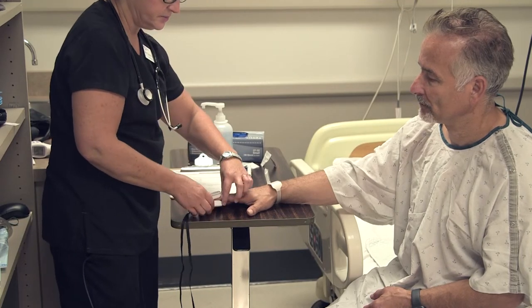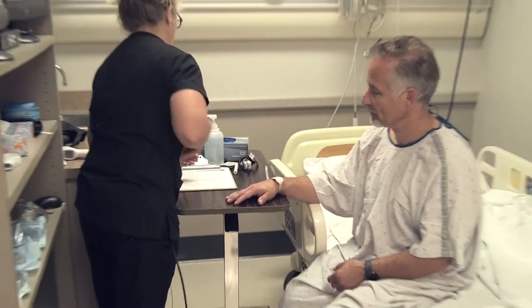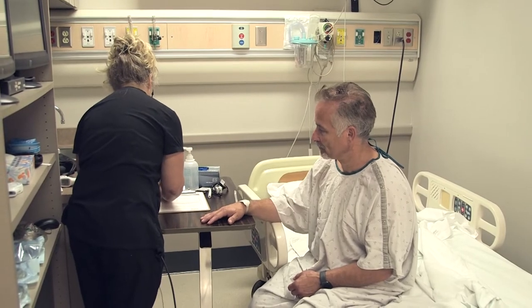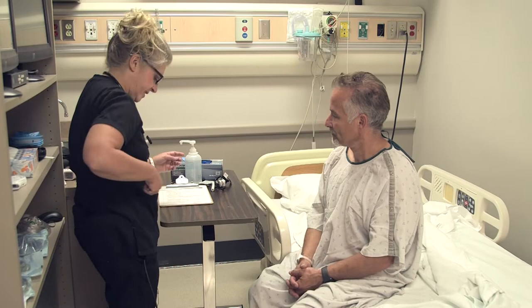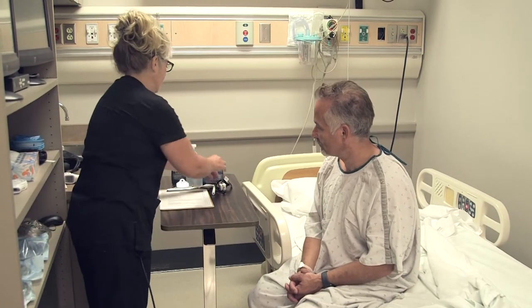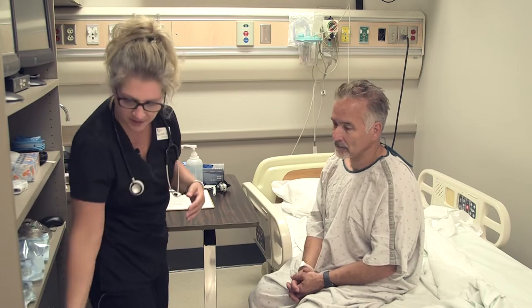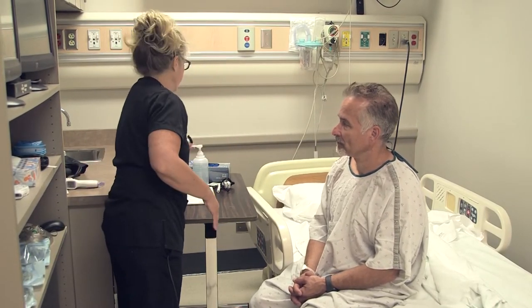Okay, excellent, Tim. Your oxygen is 98%. That's wonderful. So I'm just going to go ahead and document my findings here. Okay, good. All right. So now that we have your vital signs and all that, I'm going to go ahead and begin our actual physical assessment. Okay. All right, Tim. So I'm just going to kind of start from the head and go down.